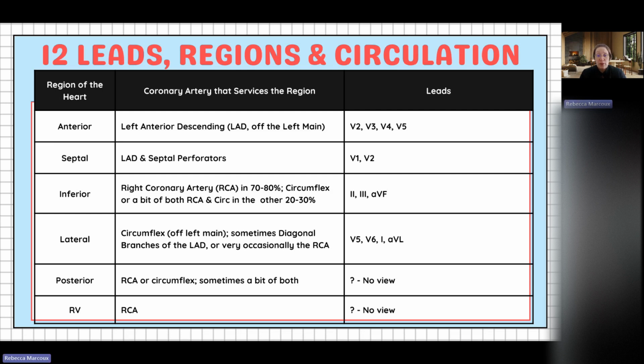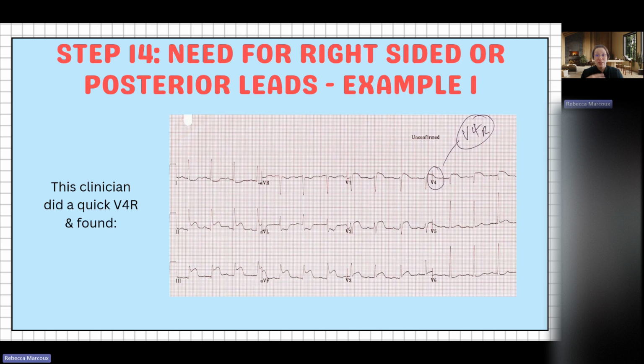I do urge you, if you ever get patients back from cath lab, wherever you work, take a look at this. When patients come to cath lab, we will map out their coronary circulation and print it on a piece of paper and send it back in their charts.